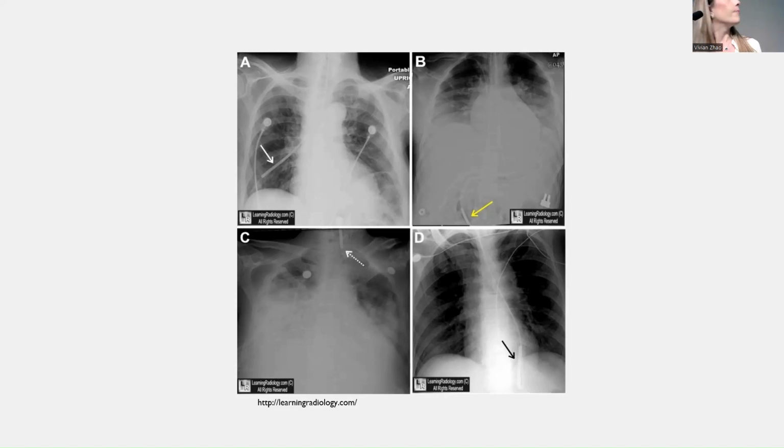the spinal cord and then over to the right, and then kind of goes back over the left, and then kind of goes back over the right. So you almost want to see it cross 3 times when you're confirming that it's actually in the duodenum, say if you're looking at a KUB. The third picture is in the cervical esophagus, and then in the fourth picture, it's in the distal esophagus. So I know that some of these may look like they're in the same place, but it's just in different places on the chest too.